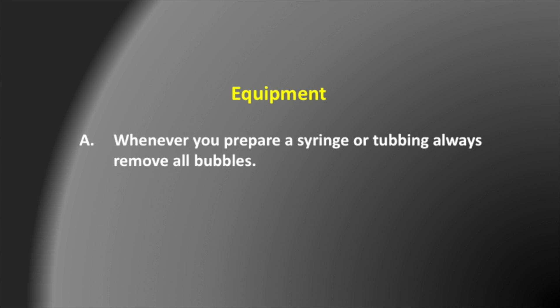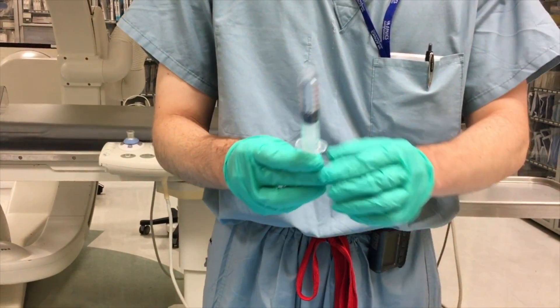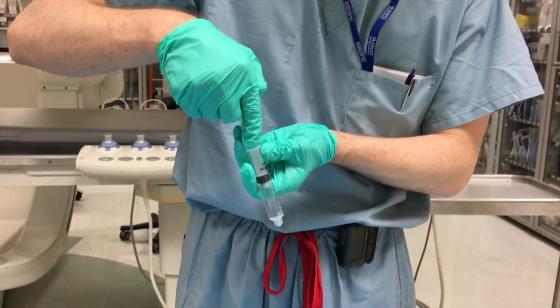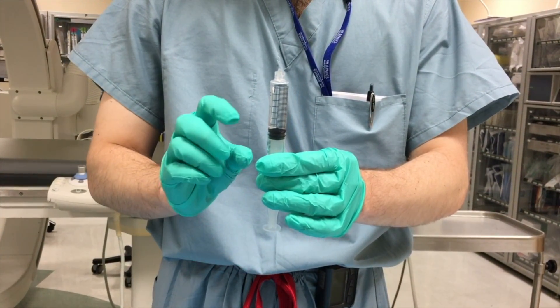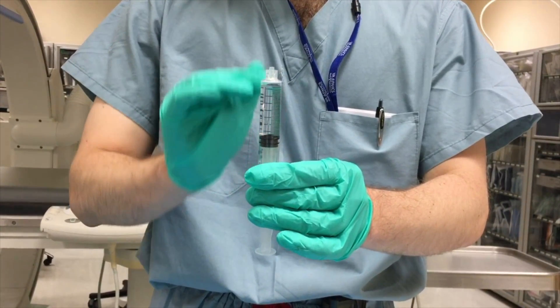Whenever you fill a syringe up with any kind of fluid and you bring it back to your team, make sure that you've got all the bubbles out. I'm going to put some bubbles in here and then show you a couple of different techniques to get them out. The most common way is to turn the syringe upside down — air will always float to the top. If you have it here, the air will go to the top.